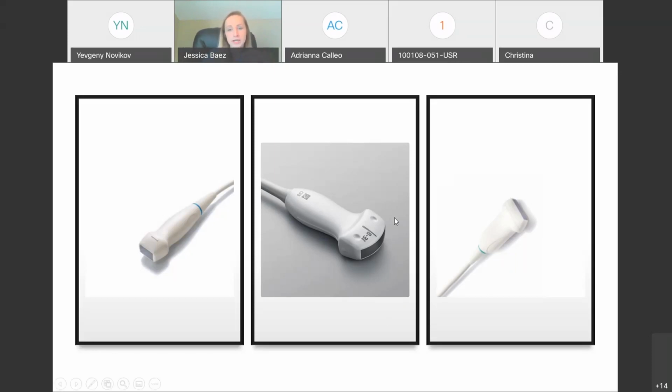So this traditionally is an intra-abdominal probe. It's a lower frequency, but is able to penetrate deeper tissues. And so this is fantastic if you're looking for pleural effusions in a more obese patient. You can find a lot of intraparenchymal pathology with this. So these two probes, the phased array and the curvilinear, are great for more intraparenchymal pathology.